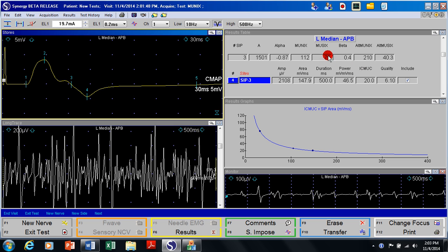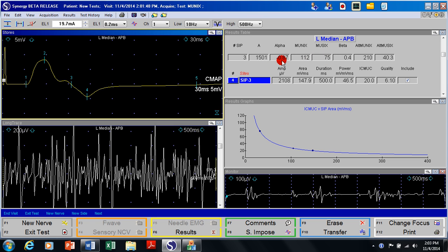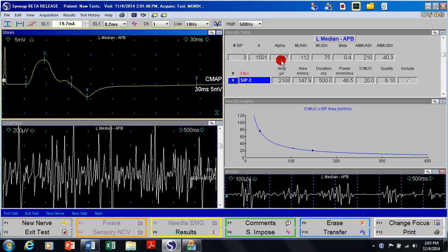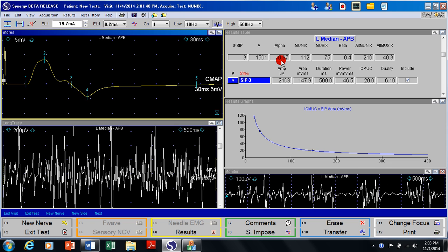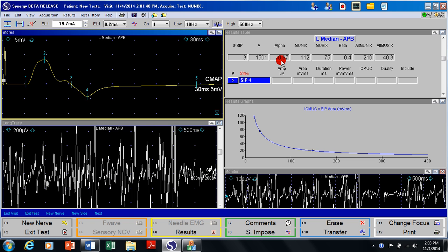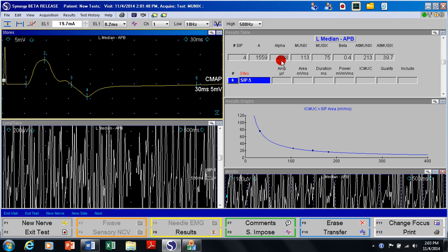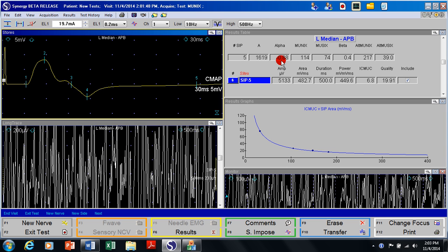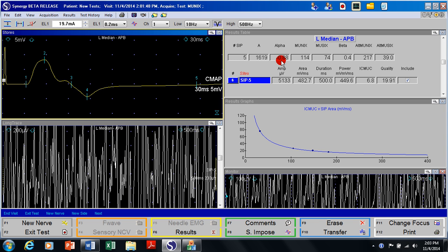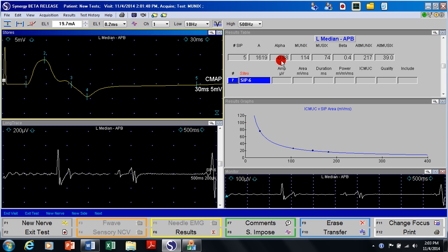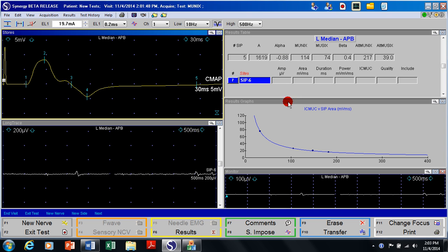A and alpha are the parameters of regression over here. Now I'm going to go to about 80% maximum effort and then maximum effort. So this completes one run of my SIP recordings. I have done five epochs.